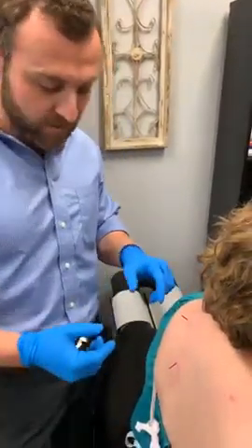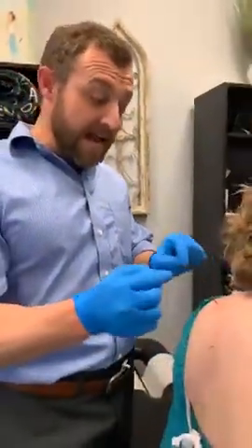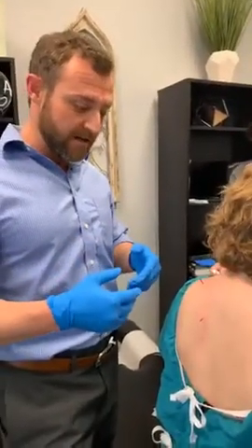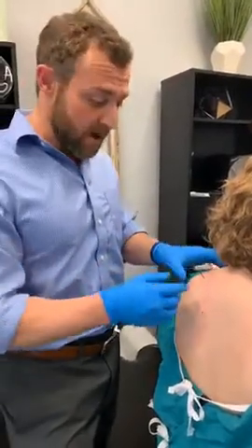Now, in some dry needling techniques, you can actually take the needle in and out of the knot repetitively, and that creates a sort of micro trauma that increases the rate of healing. In most cases, we don't find that it's necessary to do that with every single knot you find.